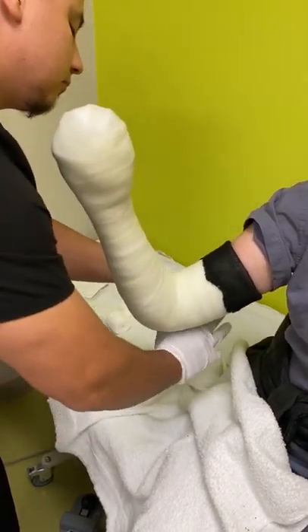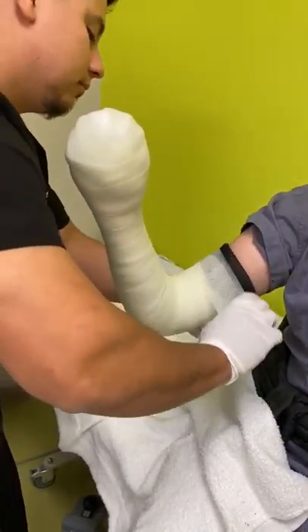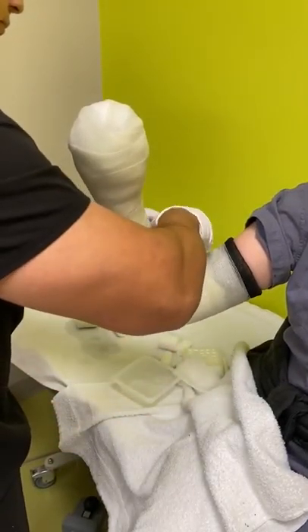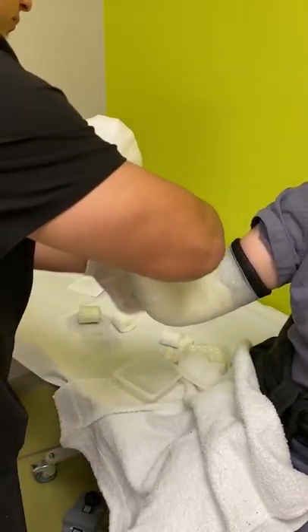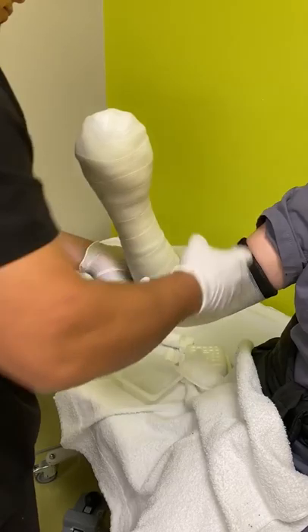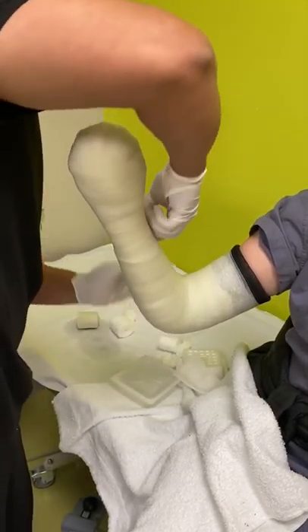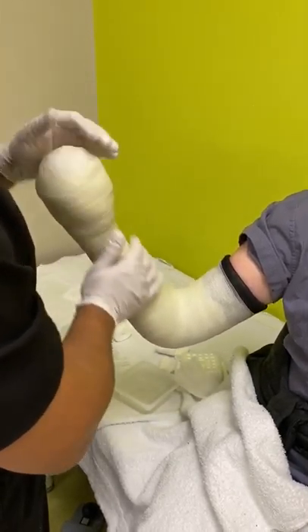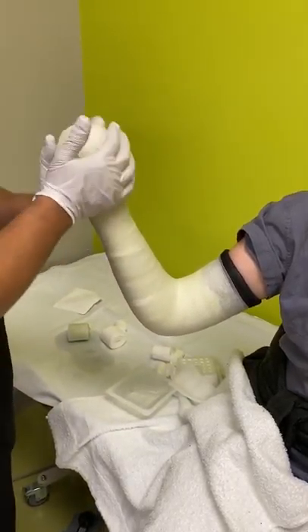Making sure there's sufficient coverage of cast material around the elbow. He has folded over the stockinette and is finishing up on his last cast roll. And that is a mitten cast from our most fabulous cast tech.